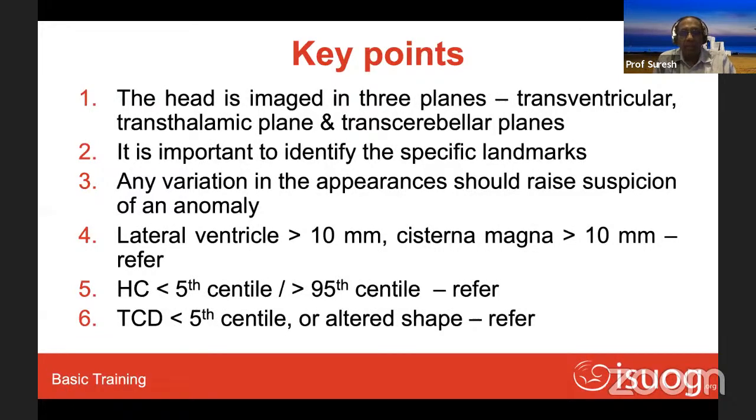If the lateral ventricle is more than 10 millimeters or the cisterna magna is more than 10 millimeters, the patient needs to be referred. If the HC is less than the 5th centile or greater than the 95th centile, or when the TCD is less than the 5th centile, or there is an altered shape of the cerebellum, the patient needs to be referred.